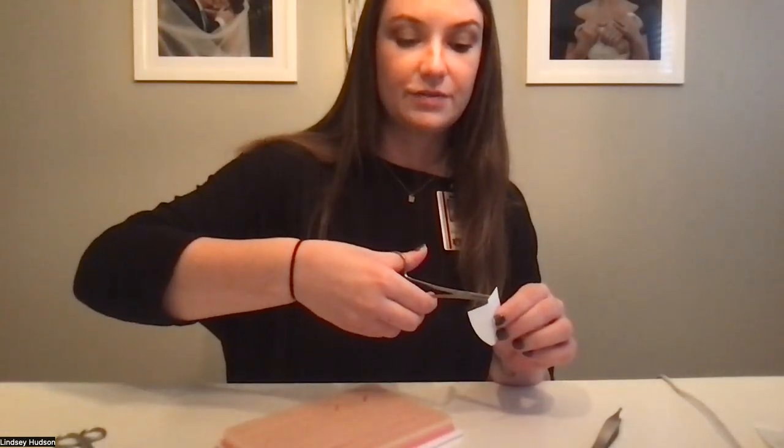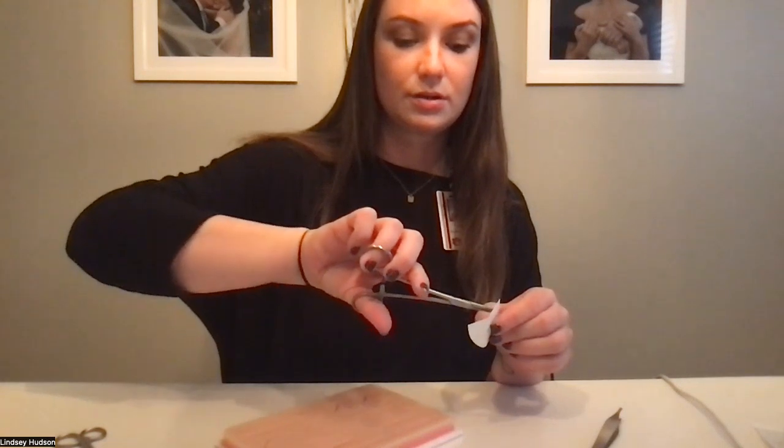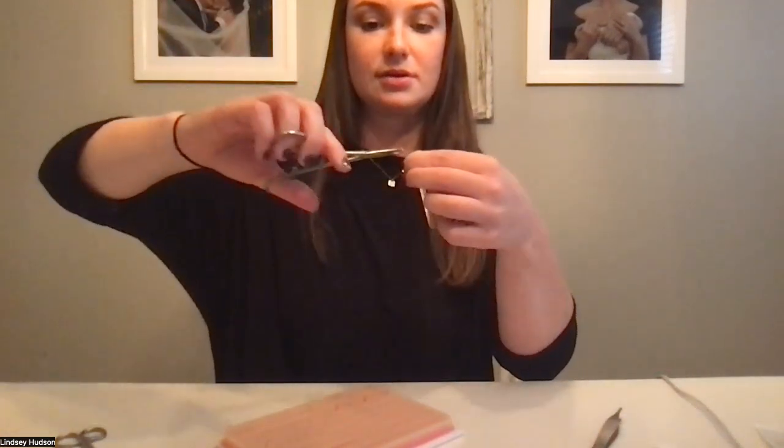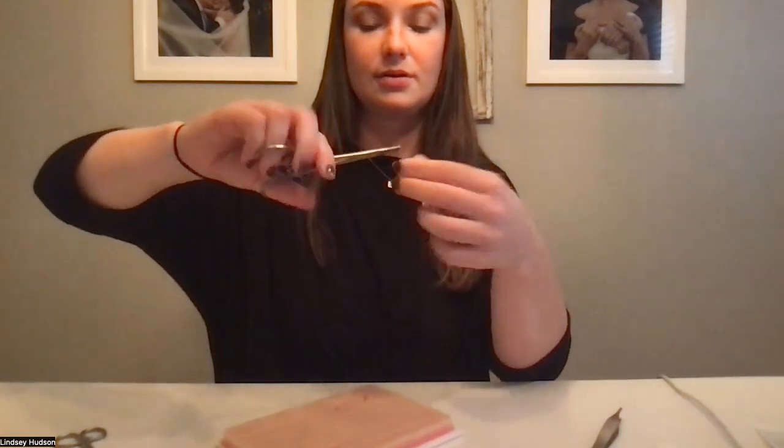So the way that we use our needle drivers is we're going to grab with the tip of the needle driver at the back of the suture, and you're going to lock it in place so that you can't drop it. And I just did that backwards. And that's how you're going to hold your suture.